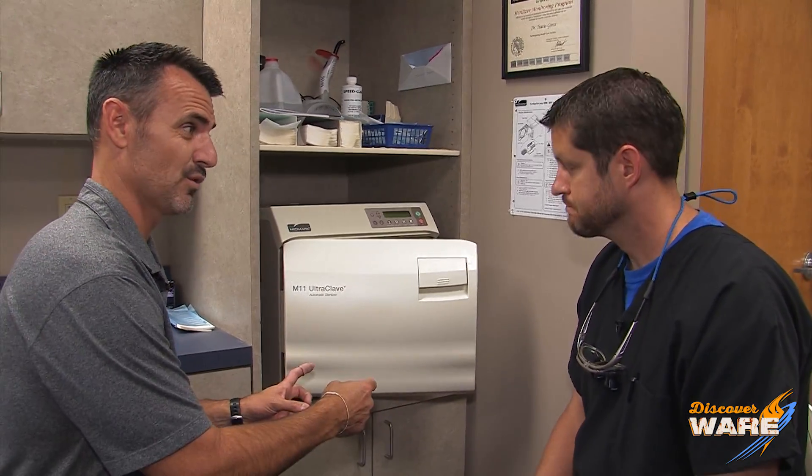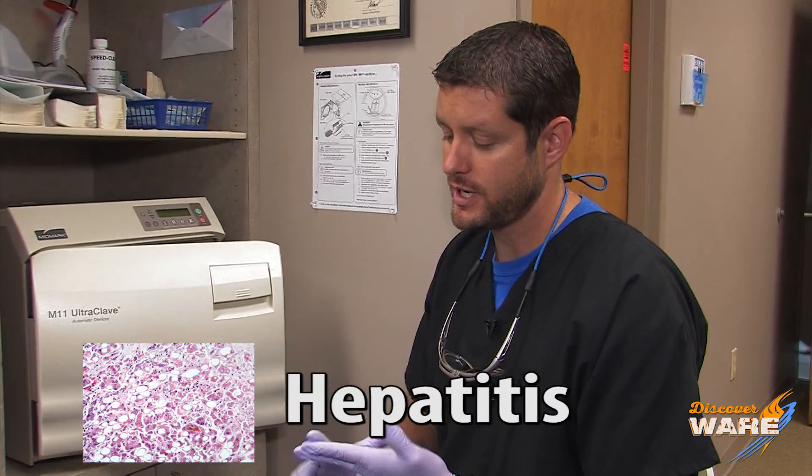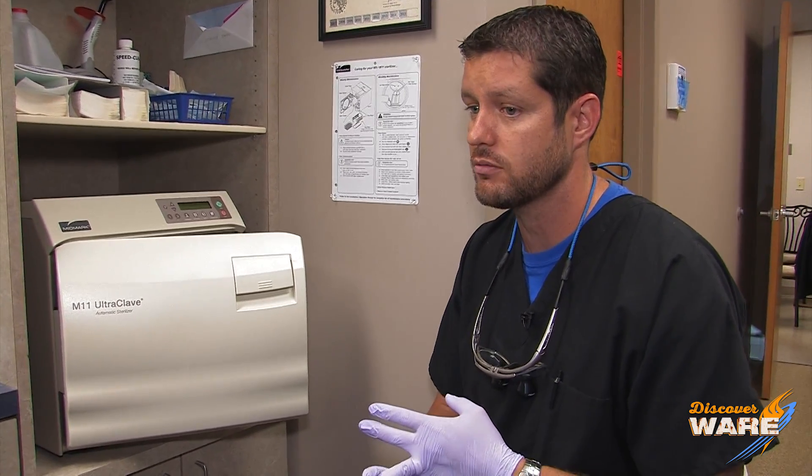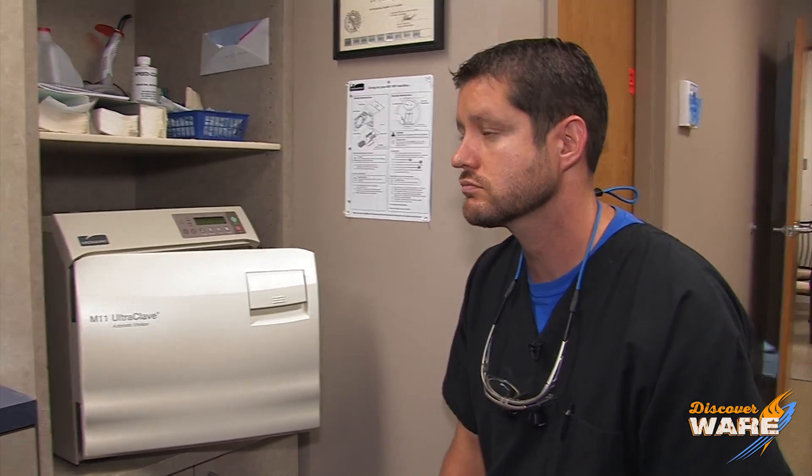You've got a lot of icky stuff going on in dentistry, and that's what this is for. The big three in dentistry: hepatitis, HIV, and tuberculosis — and steam is the best way to get rid of that. Steam is the most affordable to deliver and the safest. Our only other option is chemicals, which put our employees at risk, so steam is the way to go.